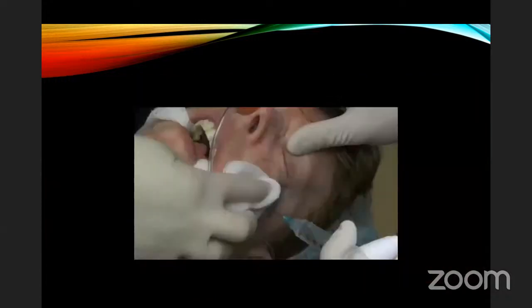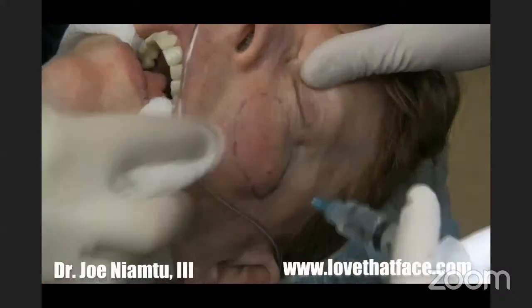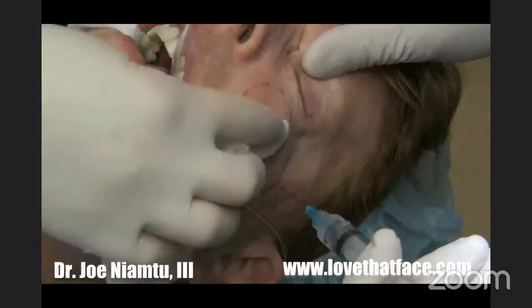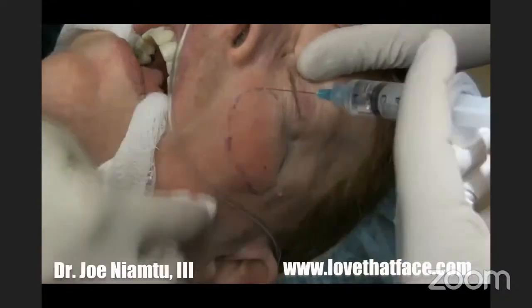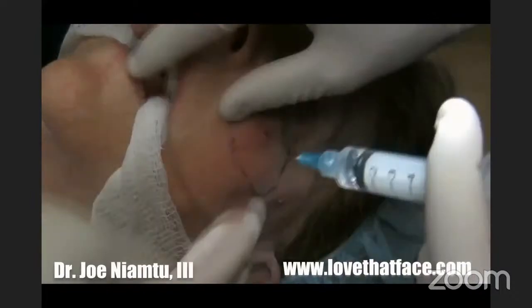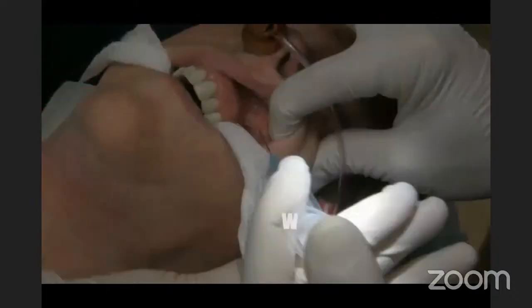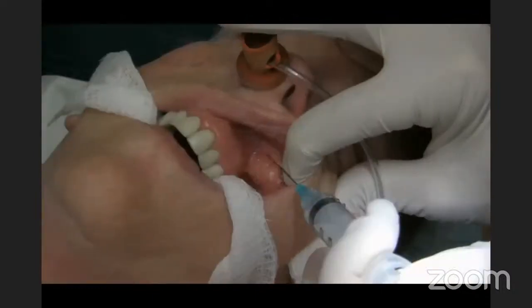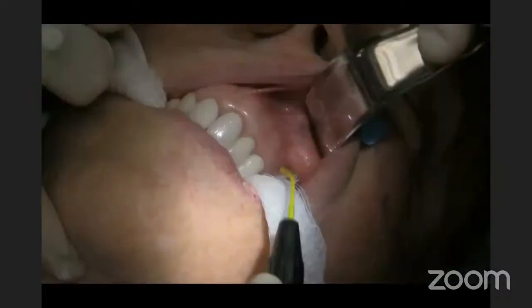We're placing a small combined submalar implant from Implant Tech, silicone implant. We're injecting 2% xylocaine, 1:100,000 epinephrine transcutaneously over the malar and submalar regions, and then going intraorally and placing a small amount, just enough for vasoconstriction on the mucosa above the cuspid region. About 6 cc's on each side is what we place total.